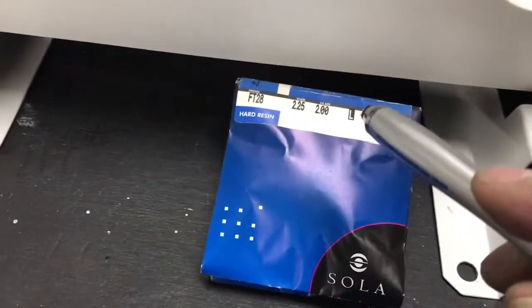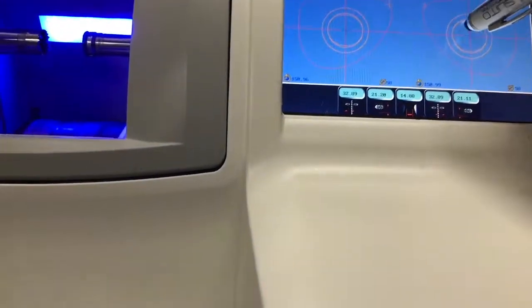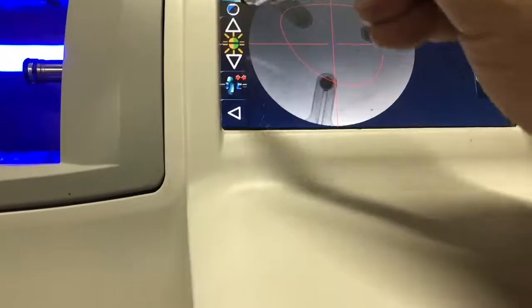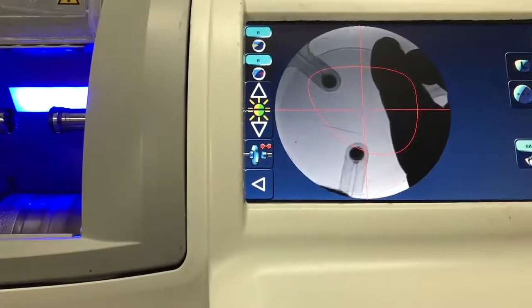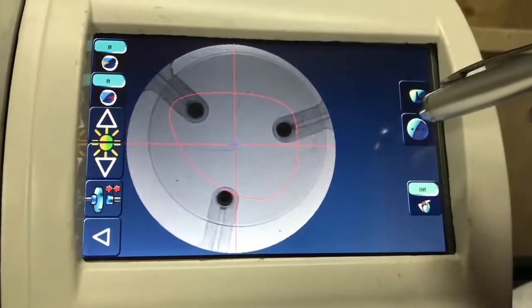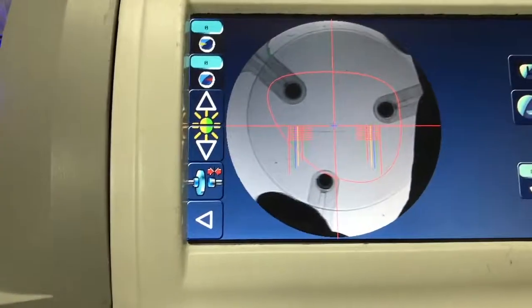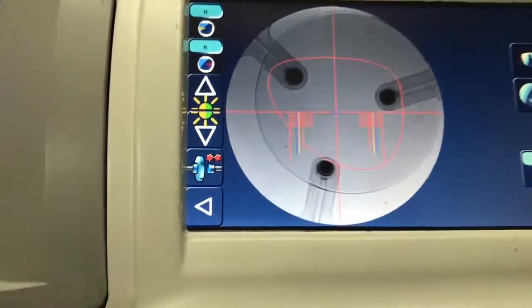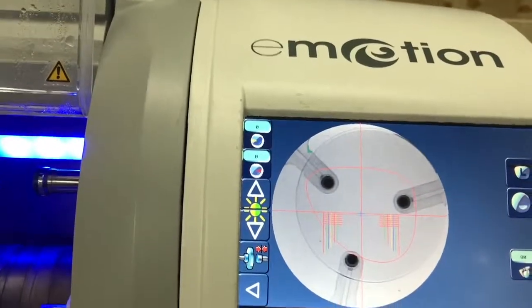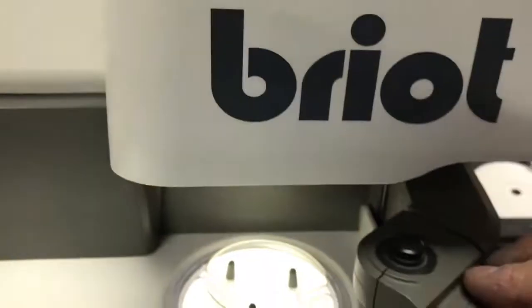Now we're making a bifocal left, so I have to choose here: left, in blocking. I can increase or decrease the light. I'm going to place the lens, and I have to tell the machine what sort of lens I want to make. There we go — that's the bifocal. We have to center it.